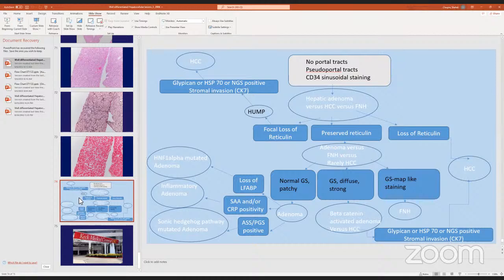Right, right. Thank you. This is very useful information, and it's very practical. Just to highlight what you have said, ultimately it boils down to the morphology and a good interpretation of a well done reticulin stain, because reticulin stain sometimes is not done properly in all the labs, and that can create trouble. And other stains, as you said, are useful, but depend on availability and interpretation.